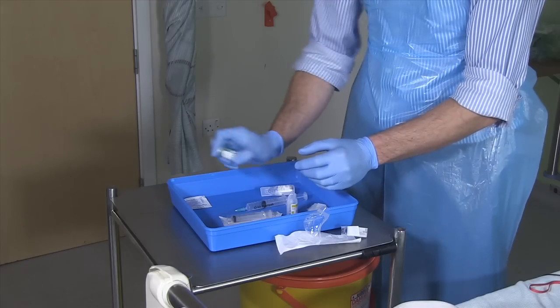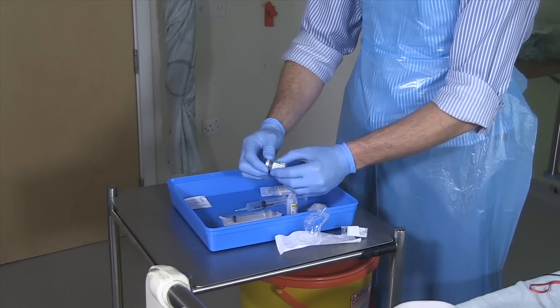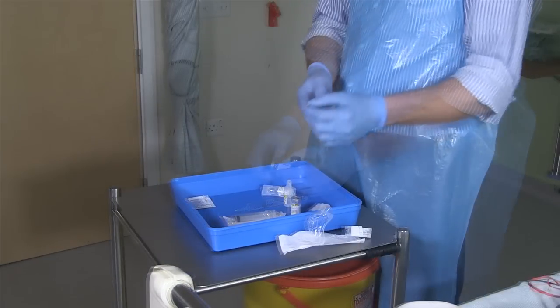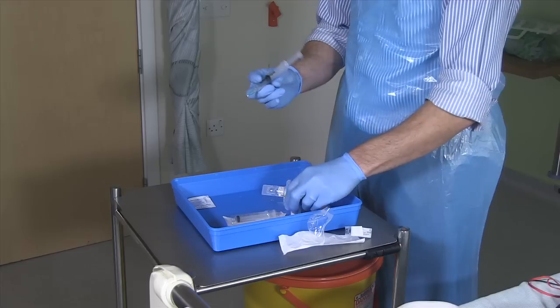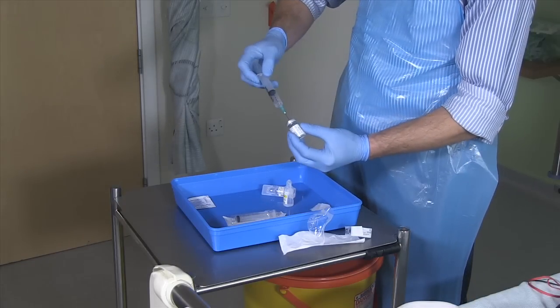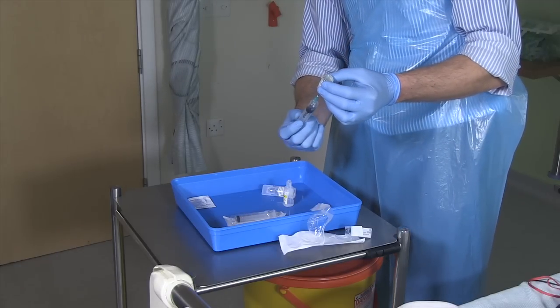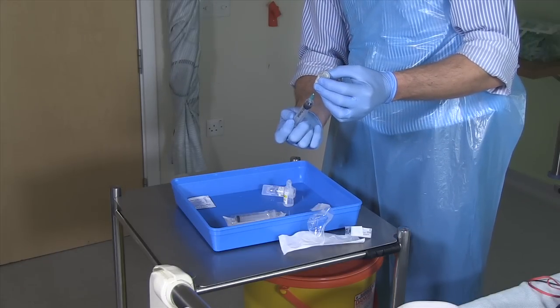Shake the vial gently to mix and check that all the powder has dissolved. Then draw up any air into the syringe that you need in order to make sure that it's equal in total volume to that which you're going to be withdrawing from the vial. Inject the air into the vial and withdraw the required volume.